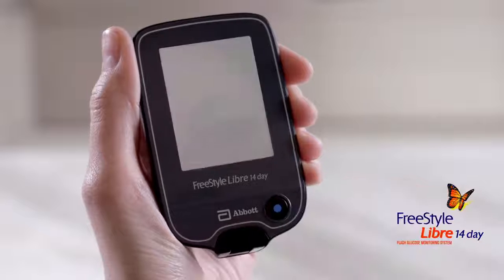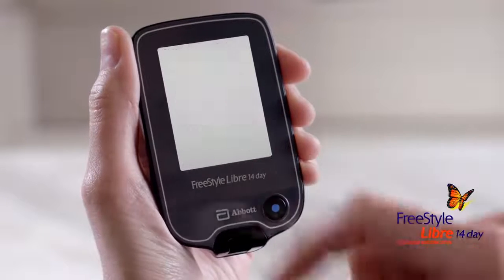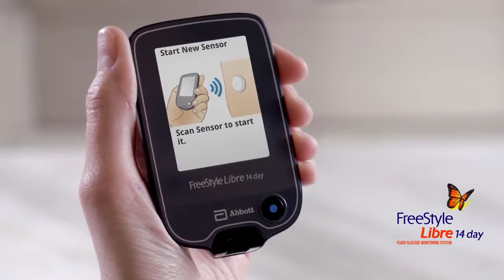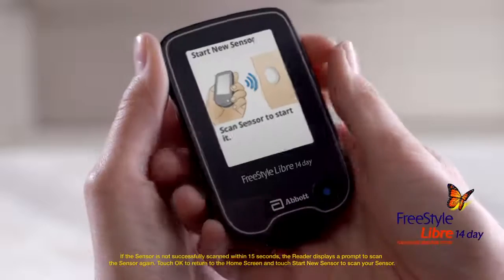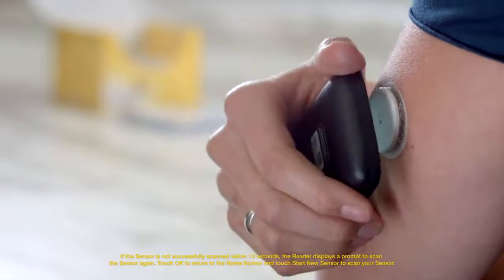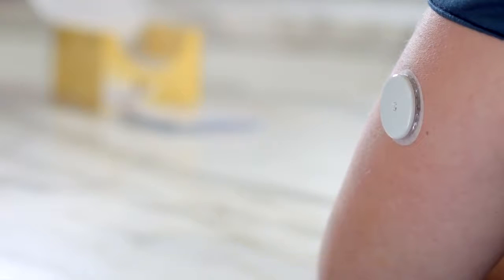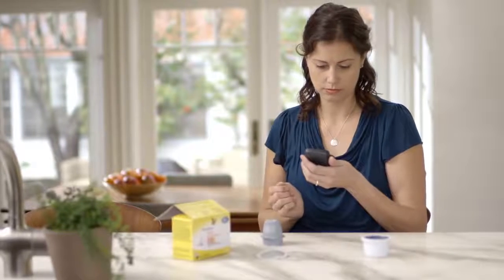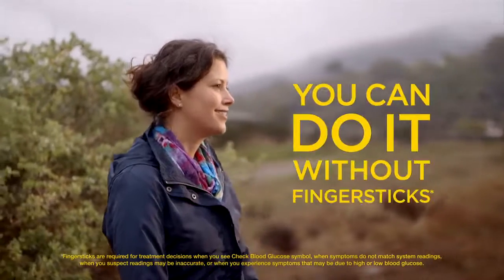Just press the blue Home button to turn on your reader. Tap Start New Sensor on the screen. An image of a hand holding the reader next to a sensor on the arm will appear. Hold the reader within 1.5 inches of the sensor to scan it. If sounds are turned on, the reader beeps when the sensor has been successfully activated. After the sensor has adapted to Helen's body for 1 hour, she can get her glucose readings with a simple scan for up to 14 days. You can do it without finger sticks.